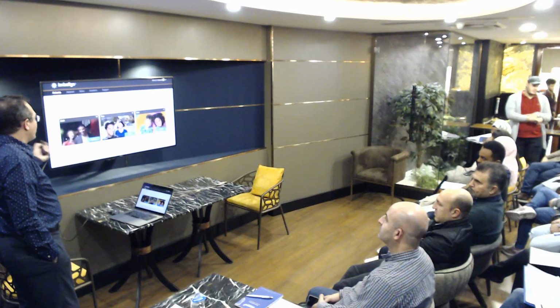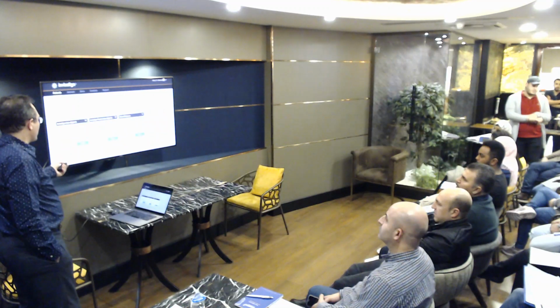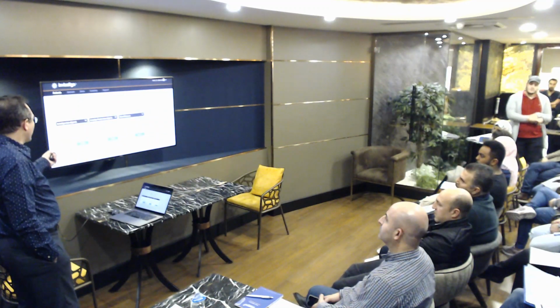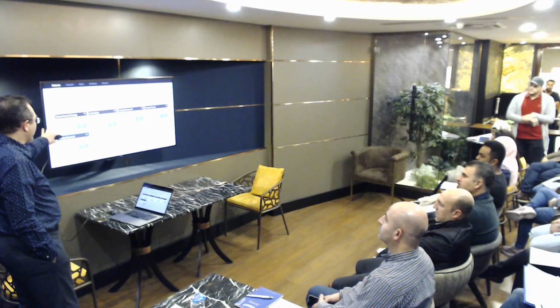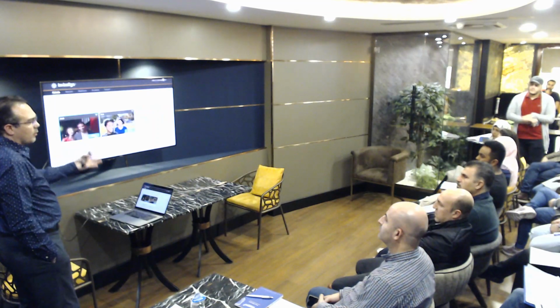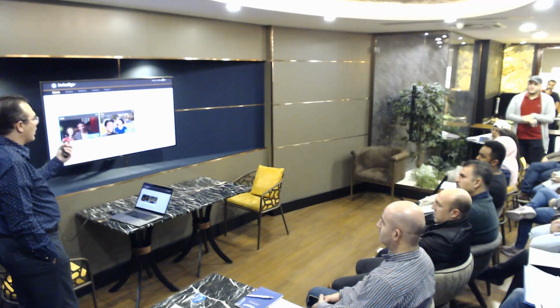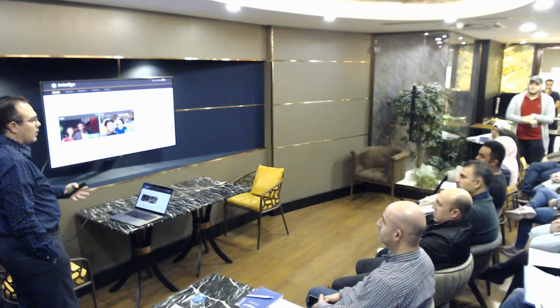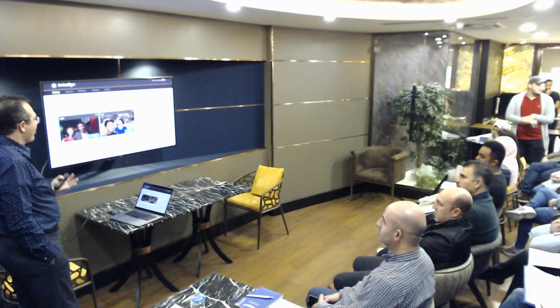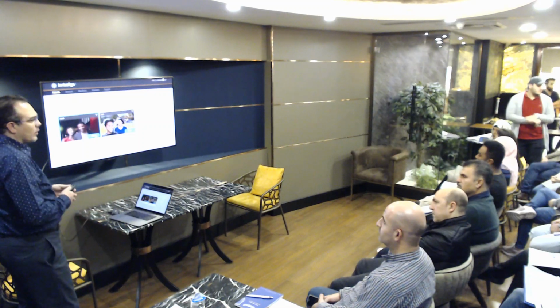Okay, there are different categories. We're just going to go for the adults because all the patients we had are adults. Invisalign clear aligners. And then we're going to choose the comprehensive package. The reason is that this is what gives you the most number of aligners and the flexibility of aligners. Just in case. The comprehensive is good for 5 years, unlimited number of aligners. So it's like a security for you.